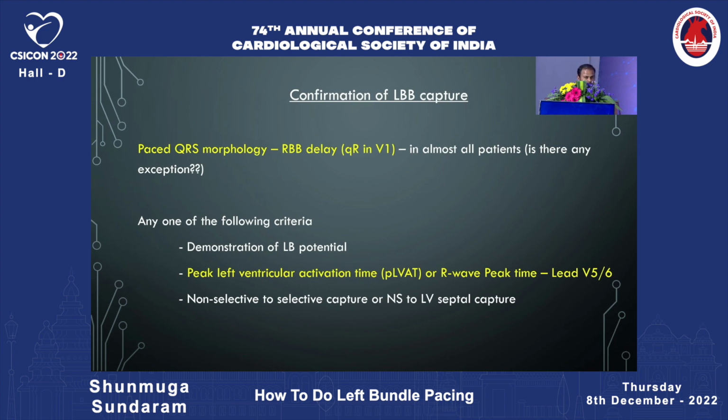Because we are pre-exciting the left bundle, we are pre-exciting the left ventricle, you need to have an incomplete RBBB delay pattern. Along with that, if any one of the other criteria is satisfied, that confirms that you have captured the left bundle.